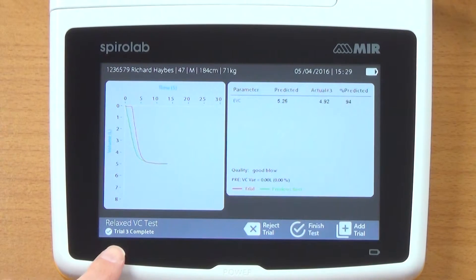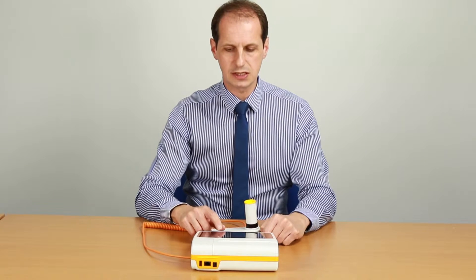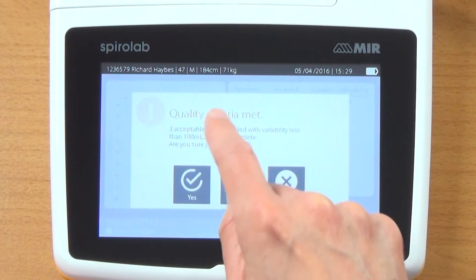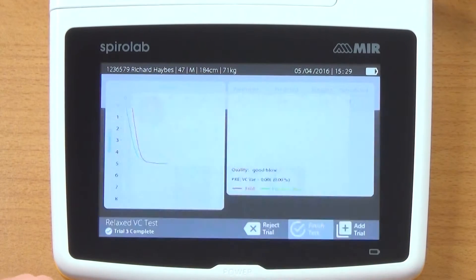Percent predicted comes up. Down here it's saying trial three complete, and we can now finish the test. Clicking on finish test — it says we've got three acceptable trials with variability less than 100 ml, session complete. If it didn't say that, it would tell you if there was a huge variation and you could click add trial. But I'm going to say yes.